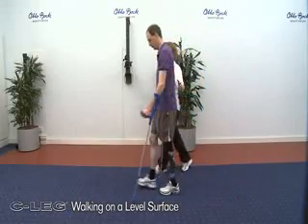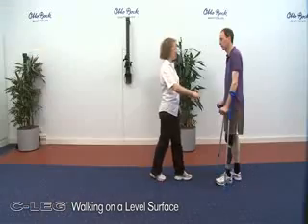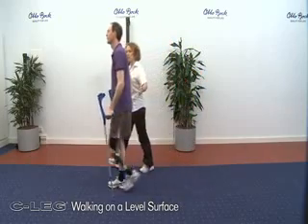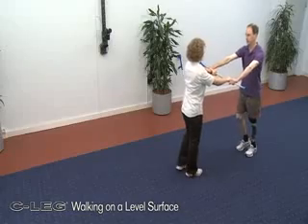The use of support devices is gradually reduced. During this process, the user learns to pull more weight on the prosthesis while the torso assumes the stabilizing function which was previously performed by the arms. As a result, the patient's body posture improves and a more harmonious gait pattern is achieved.